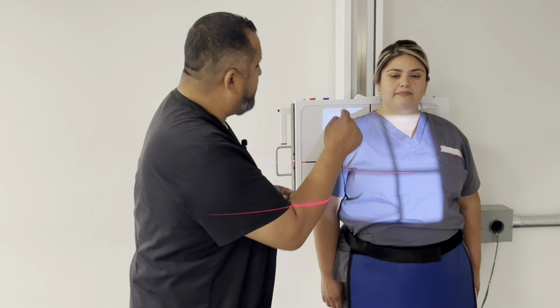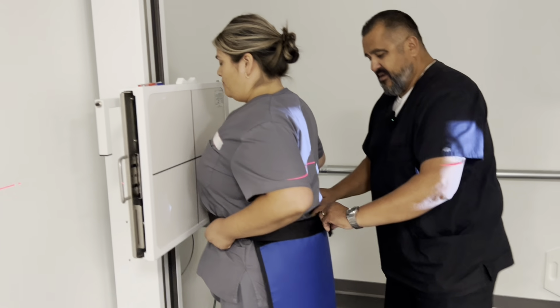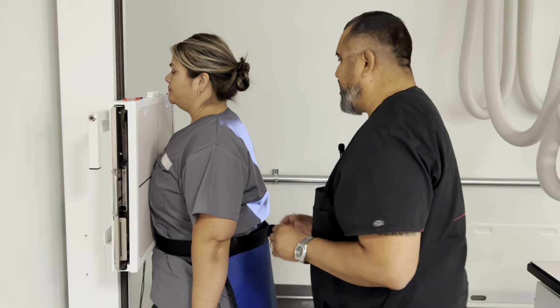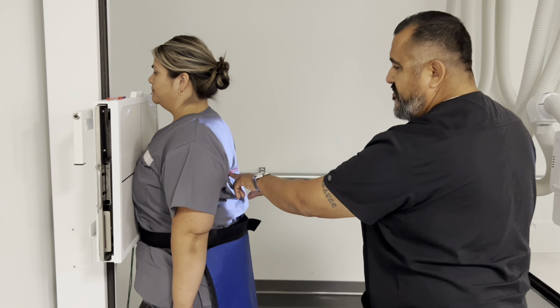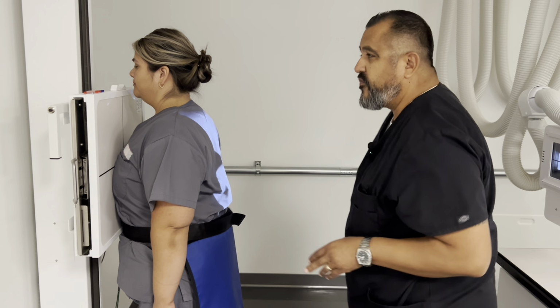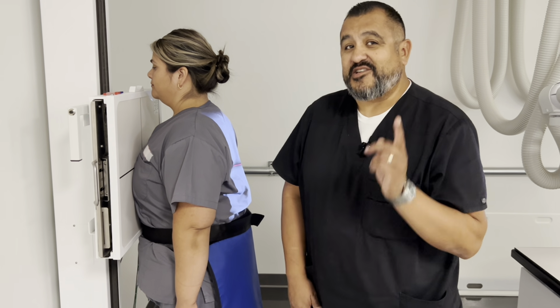So let's go ahead and have you face the board now. We got a shield on here. We're going to turn it so that it's going to be towards the primary beam. All right. We're going to have you face the board here just like that. The level of T7, we're going to be at the level of T7. And what we're going to do first, we'll do a PA oblique and we're going to do an RAO position.